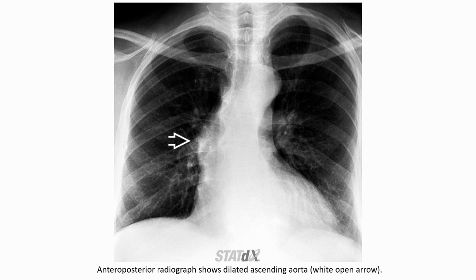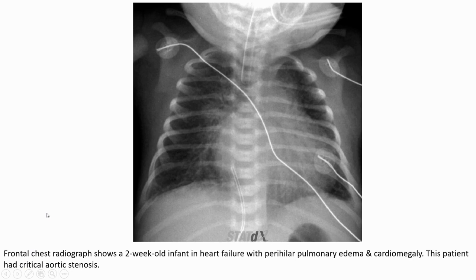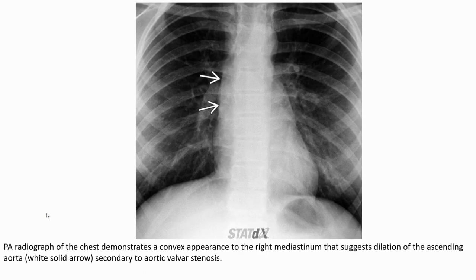The AP radiograph shows a dilated ascending aorta. This is a case of a neonate with heart failure, showing perihilar pulmonary edema and cardiomegaly. This infant had critical aortic stenosis — in this case usually related to a congenital condition. The PA radiograph demonstrates convexity to the right mediastinum, suggesting dilatation of the ascending aorta secondary to aortic valve stenosis.